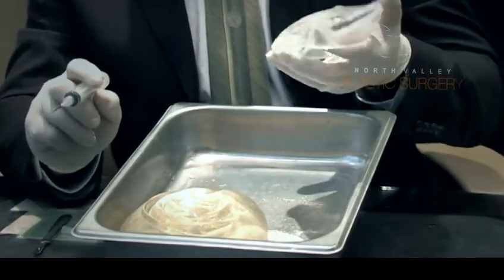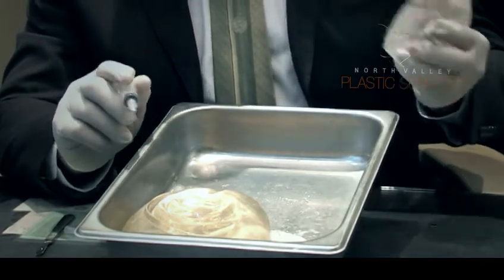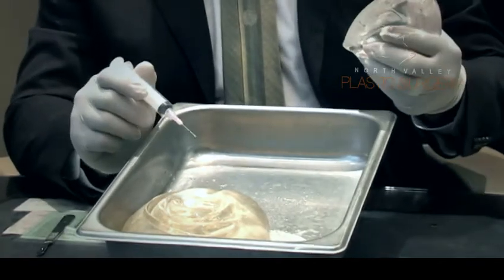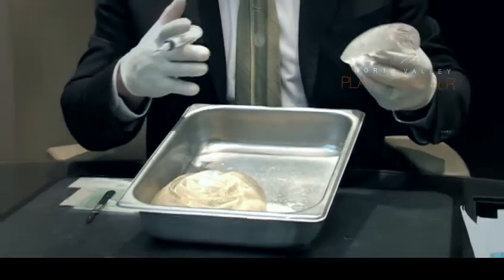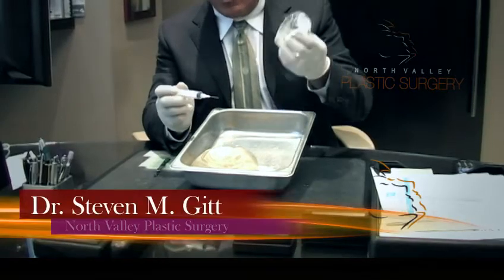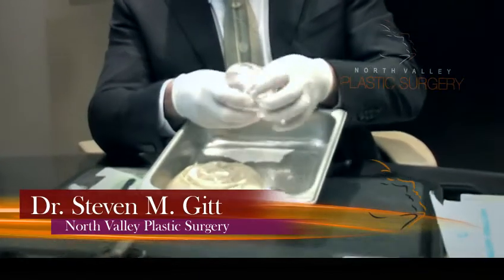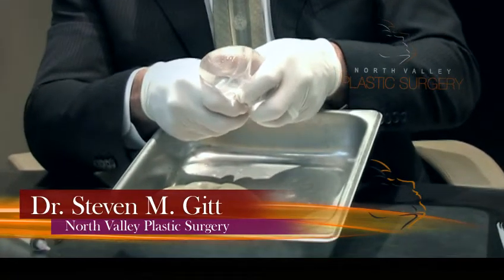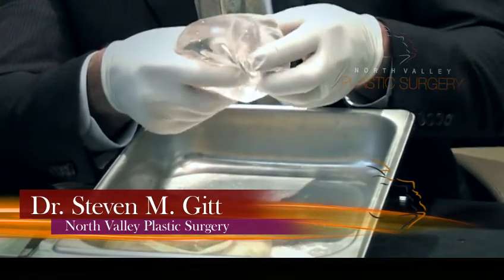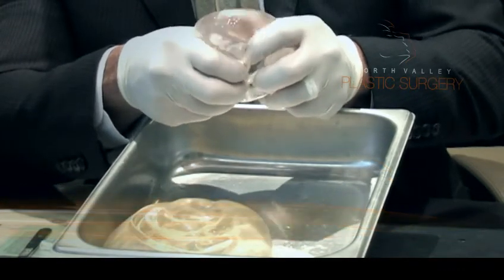Now, I mentioned earlier that the third generation silicone gel breast implant is a better implant and has a much lower tendency to leak. Recall a few moments ago when I placed a hole into this second generation silicone implant, the silicone tended to ooze out and the hole tended to expand. Now when you take a third generation or a modern silicone gel breast implant and you poke a hole in it, for the most part that silicone's not going to want to come out. It may come out just a little bit and then it'll go back in for the most part when the implant relaxes. So if a patient contracts her pectoral muscle and squeezes the chest, a little bit will ooze out and then it'll want to go back in.